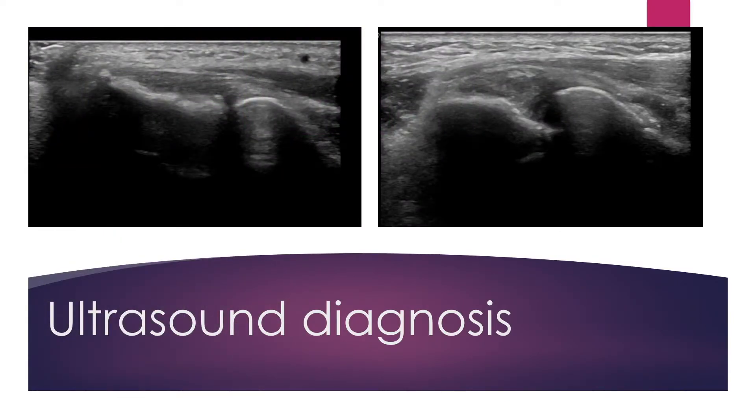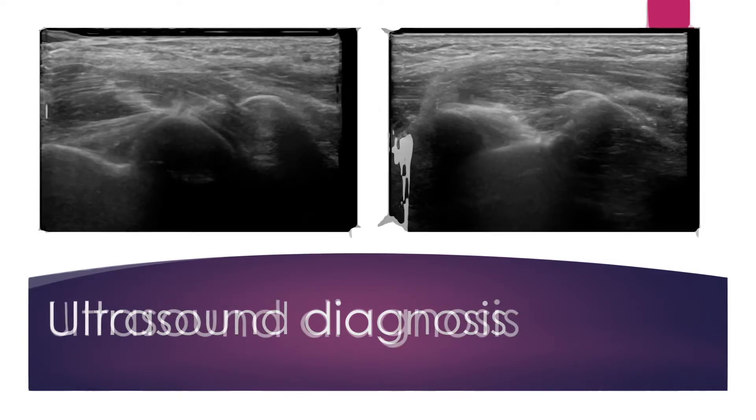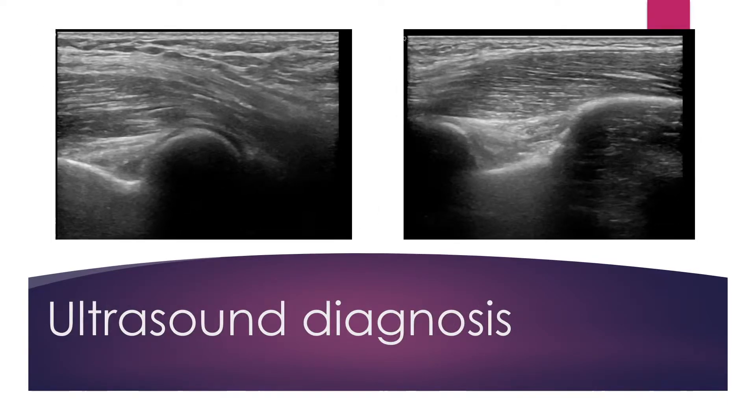On ultrasound diagnosis, there are cortical irregularities on the lateral facet of the lateral epicondyle and low echogenicity of the extensor tendon. There is also mild effusion in the anterior coronoid fossa and posterior olecranon fossa.